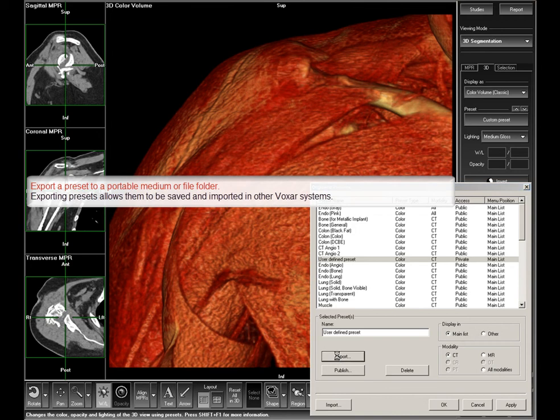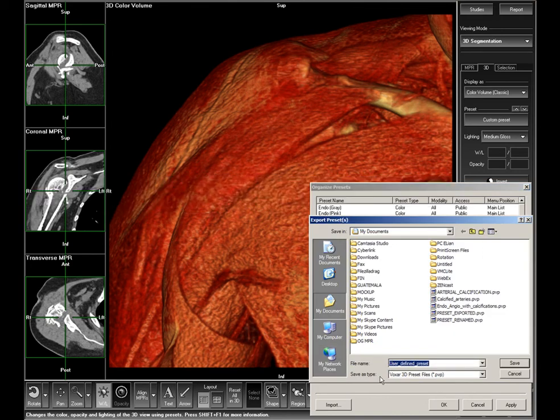To export a preset to a portable medium or file folder, click Export. Locate and save the file. Exporting presets allows them to be saved and imported in other Voxar systems.